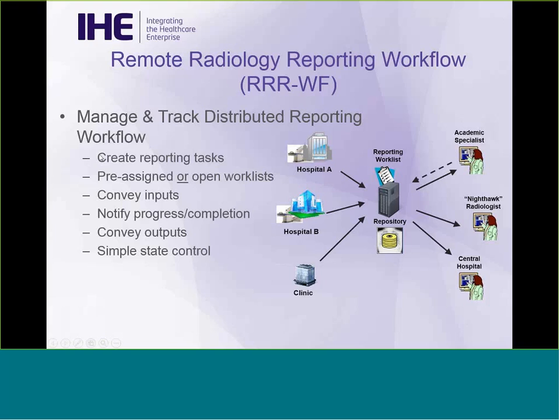So you're going to need, is my pointer visible? Yes. Oh, good. Okay, so I can point to things. So the create reporting tasks, that's the essence of this. Each of these places needs to be able to create a reporting task that others will be working on. There's the concept of pre-assigned and open work lists.